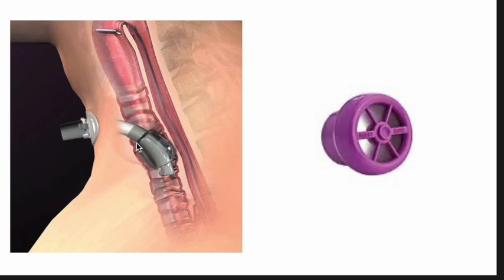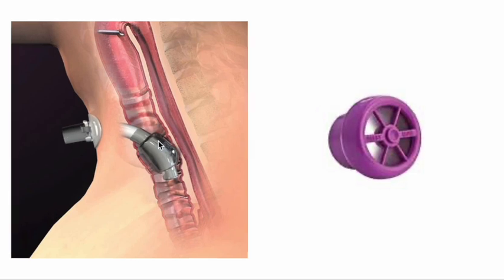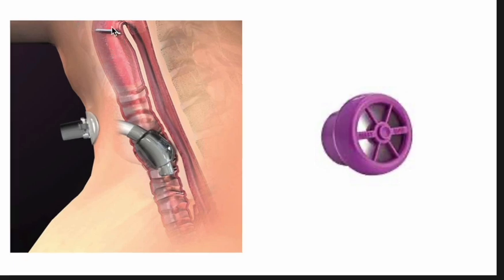What if a patient with a tracheostomy tube wants to speak? Should this balloon be inflated or deflated? Yeah, it should be deflated so that the air goes up and engages the vocal cords. So imagine that you're rounding on a patient with a tracheostomy tube, and you go to talk to them, and they're trying to talk, but they can't quite make sound. What do you think the issue is? Well, the problem is that when they're going to talk, the air is going up and it's engaging the vocal cords, but it's also getting blown out here. There's just not enough airflow coming up the trachea and engaging the vocal cords to cause them to vibrate and create sound. So you need something to keep the air from going out of the tracheostomy tube and just going up and engaging the vocal cords. And that's this here. And this is called a passy-Muir valve.